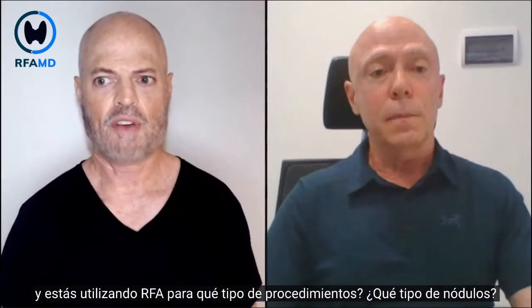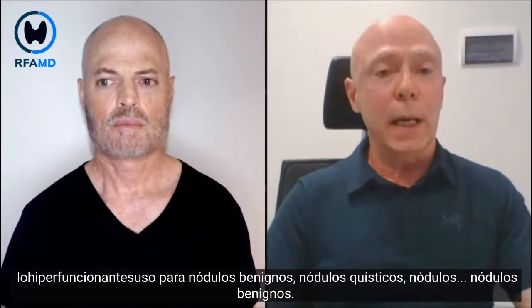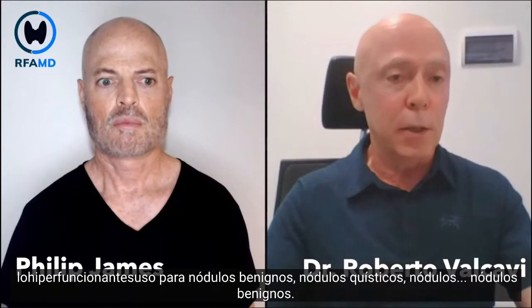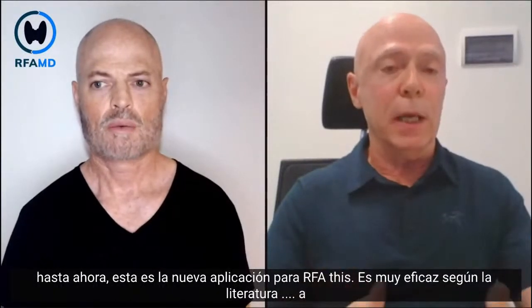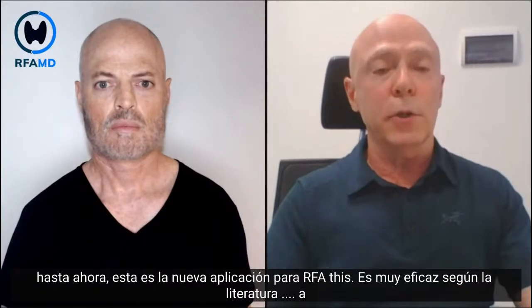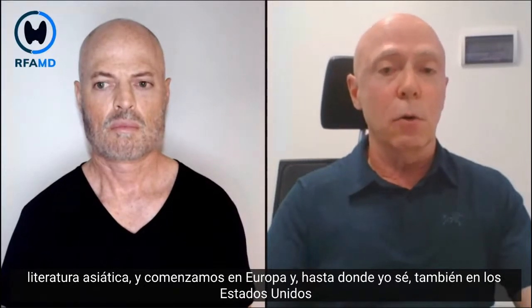And what type of nodules are you using RFA for? I use it for benign nodules, for cystic nodules, for hyperfunctioning nodules, and this is the new frontier: I use radiofrequency for malignant micropapillary tumors. This is the new application for RFA. This is very effective according to the literature, to Asian literature, and we started in Europe and, as far as I know, in the United States too.